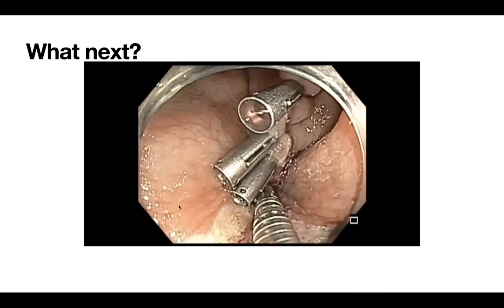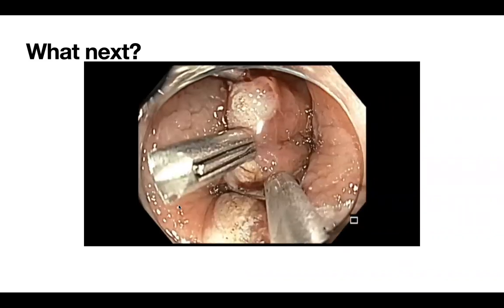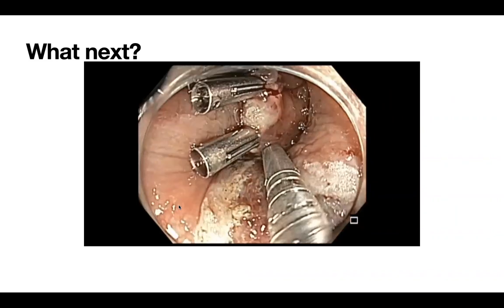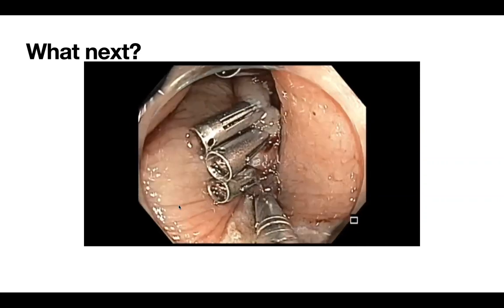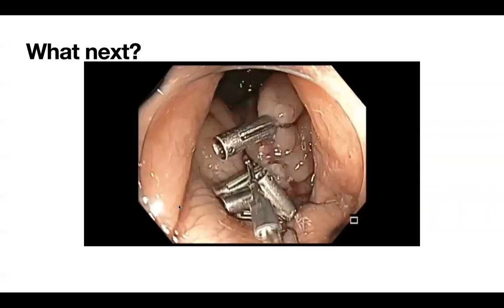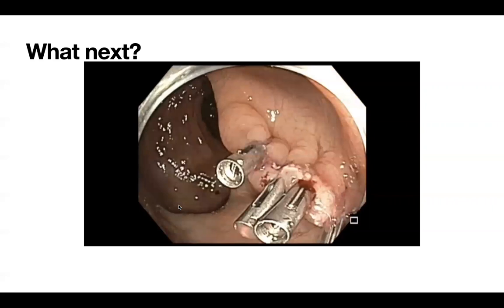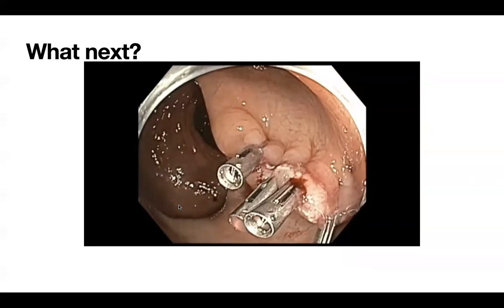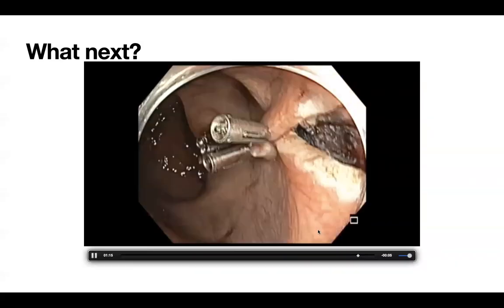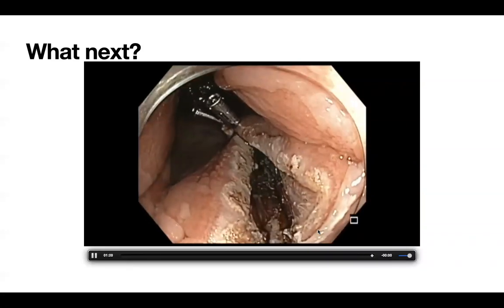And I'm also trying to get a deep approximation to make sure that I get as many of the blood vessels as possible. And so now I stop there, right? As you can see here, I come down and I just leave that lower portion without closure because I don't want to impinge on any of the hemorrhoids.